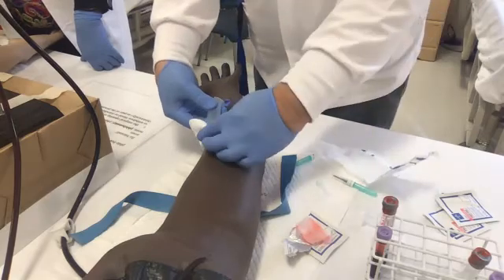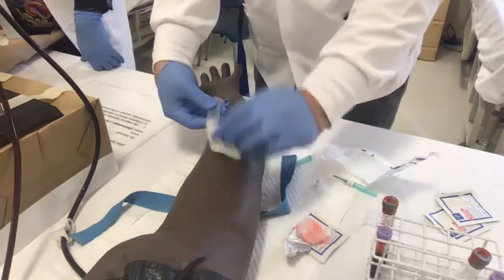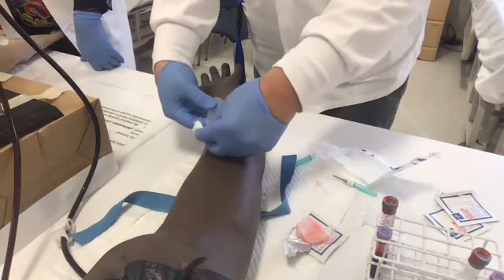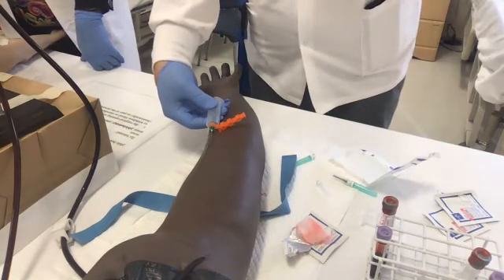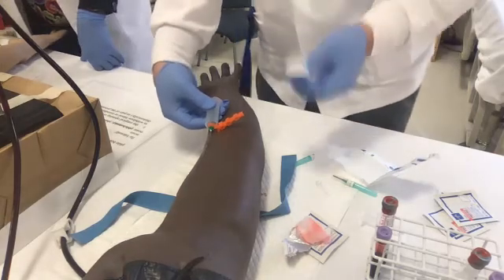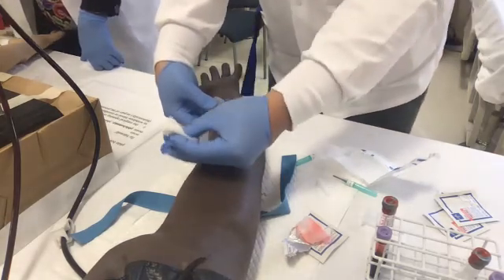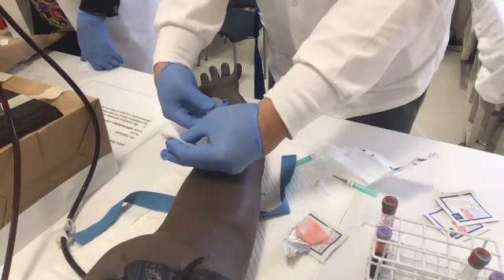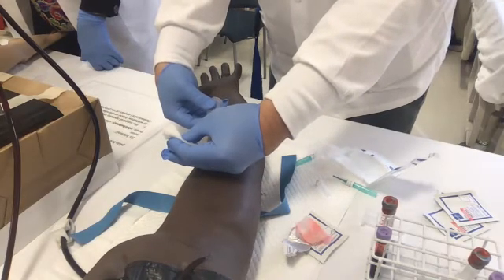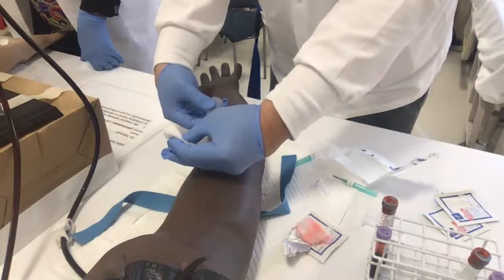And it's venous blood. Even if I let go right now, it's just going to ooze out. Now, the textbook says you wrap your gauze like this and put it right on top of the needle. I learned in EMS that's not a good thing, because you're in a moving vehicle. I like doing it like this, putting it far away. And you see, I'm also now holding my patient's arm, because your patient's going to be anxious. They're going to want to move that arm.